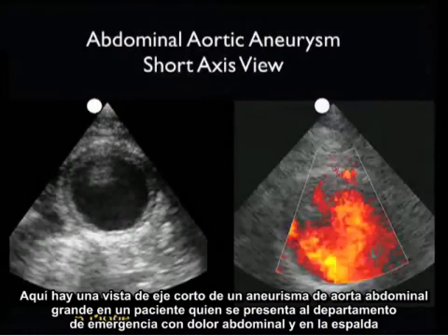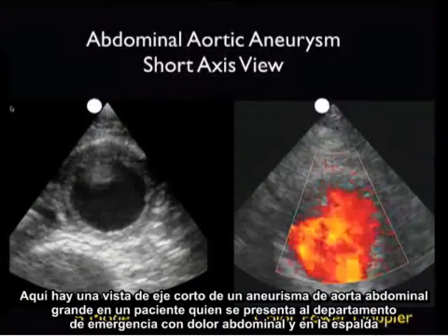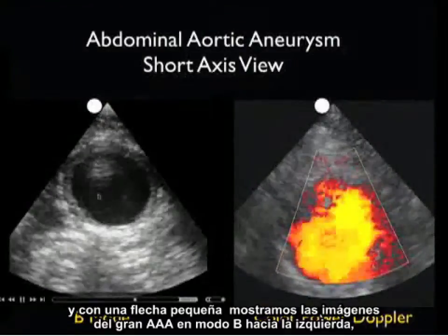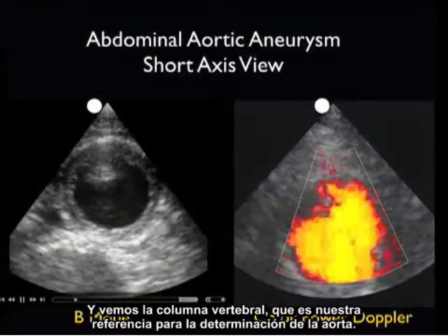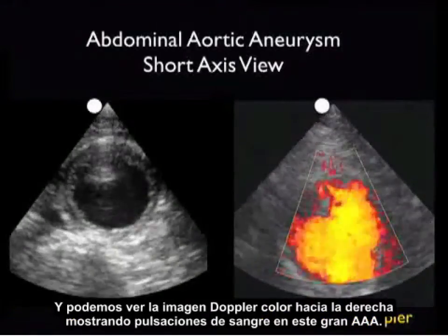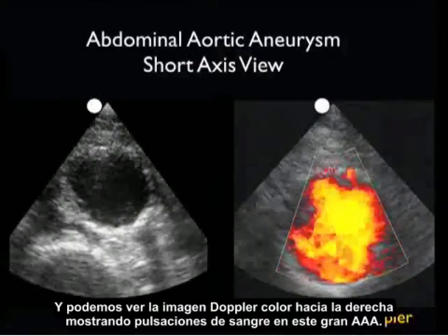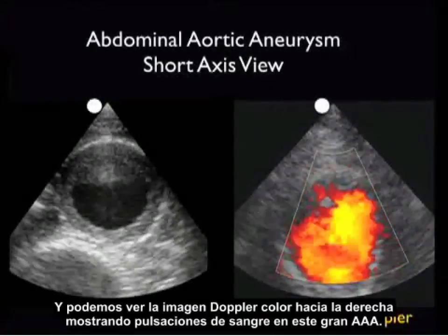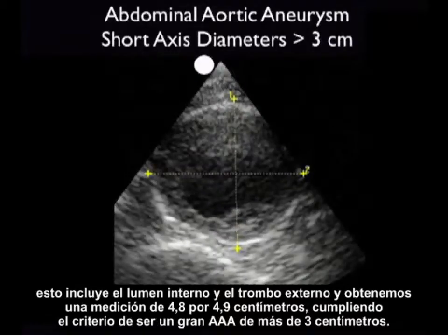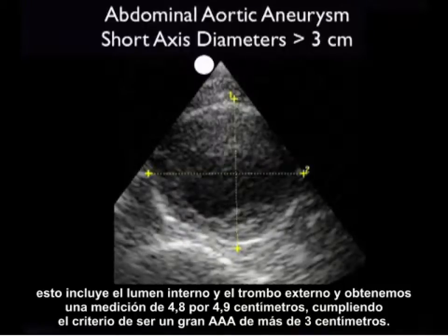Here's a short axis view of a very large AAA in a patient who presented to the emergency department with abdominal and back pain. The B-mode image shows the large AAA with the spine as our landmark, and the color power Doppler image shows pulsations of blood within the AAA. Measuring from outer wall to outer wall in short axis configuration gives 4.8 by 4.9 centimeters, meeting the criteria of a AAA greater than 3 centimeters.